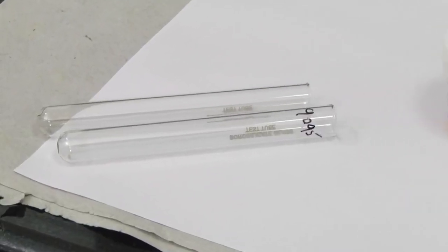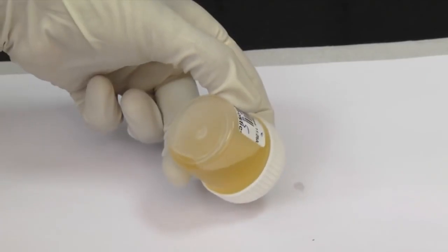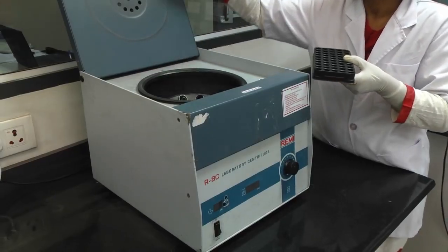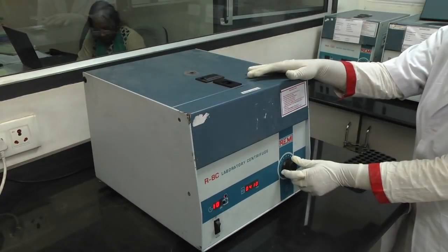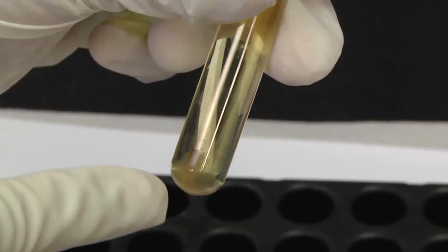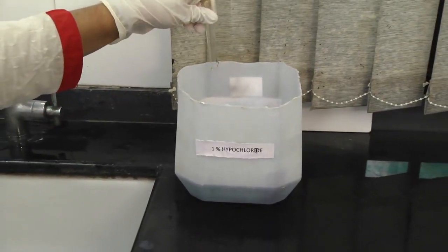Label the test tube with the patient ID to which the sample is to be transferred. Mix the sample well before testing. Transfer 10 to 15 ml of sample to a test tube and centrifuge at a speed of 1500 rotations per minute for 10 minutes. After centrifugation, concentrated sediment is collected at the bottom with a clear supernatant. Pour off the supernatant till a volume of 0.2 ml is left inside the tube.